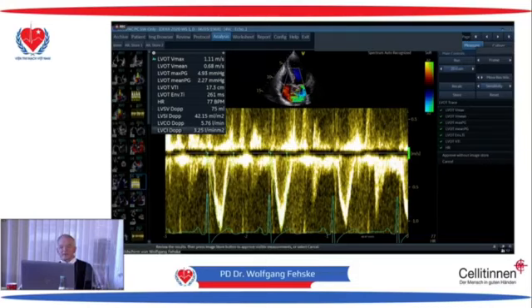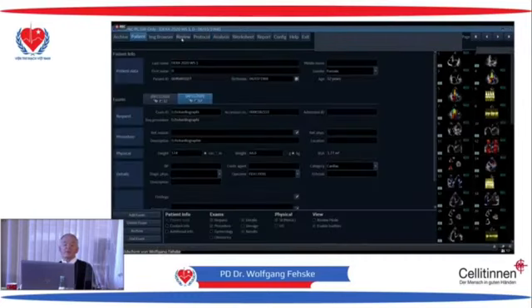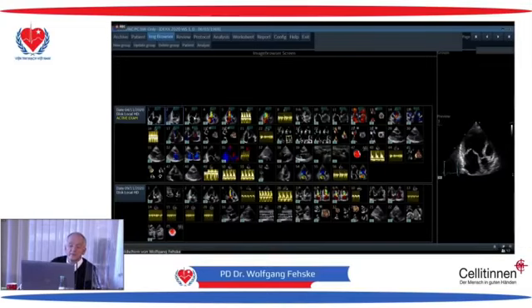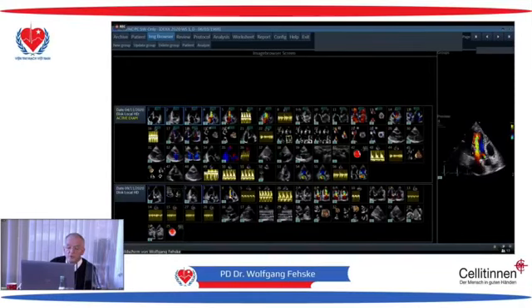I accept that this patient is not decompensated. This is a good cardiac output because we have measured it in the left ventricular outflow tract. This is the only thing we have. But when the patient is operated, it is really interesting to know, comparing what we had before to what we have afterwards.